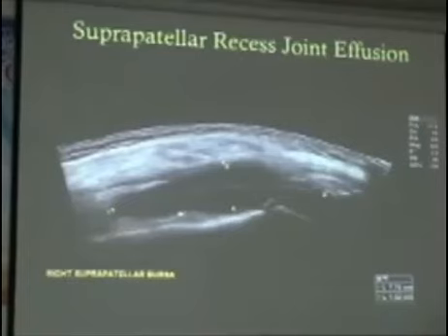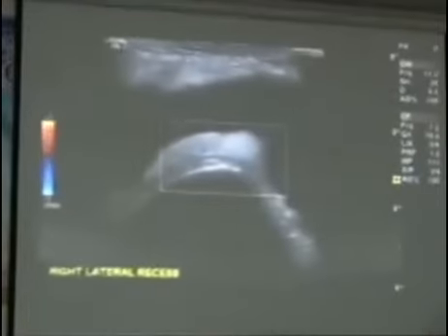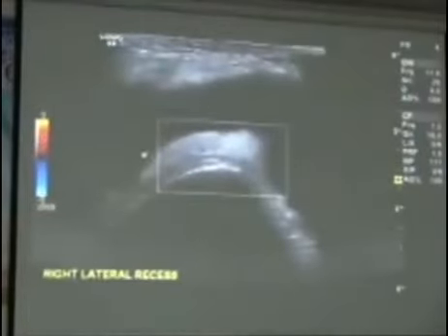And this is that prefemoral fat pad just in here again. So it's important not to mistake that, which is a normal structure, for a bit of synovitis. Một lần nữa, đây là hình ảnh của cái giường mỡ trước xương bánh chè và đừng có làm lẫn nó với tình trạng bệnh lý. So this is that fat pad just in transverse plane. So sometimes you can see a little bit of vascularity in there as well. Đây là cái hình ảnh của giường mỡ trước xương bánh chè, trước xương đùi cắt ngang và đôi khi nó có tăng sinh mạch máu nhẹ.